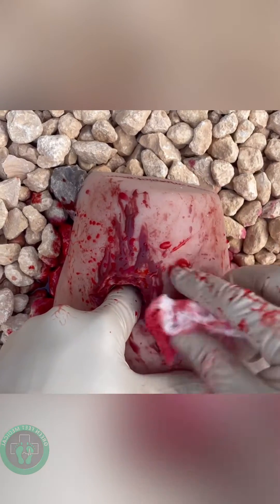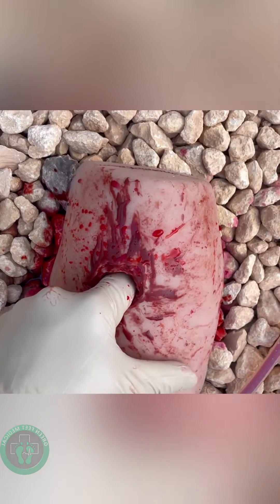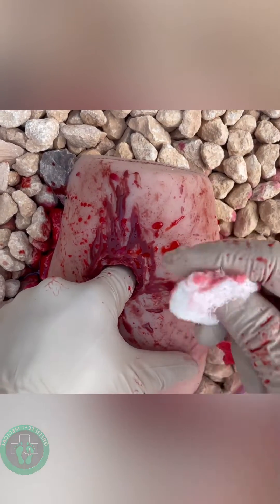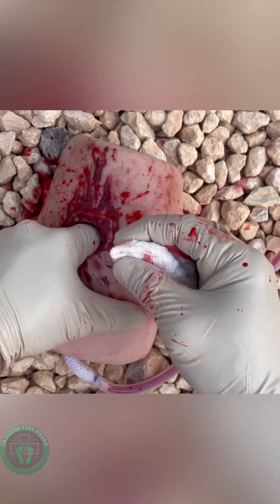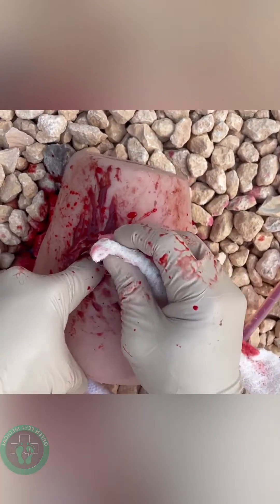So once I've found the bleed, I can visually inspect. If I can't visually find it, I'm going to feel for it. Then I'm going to take my gauze and create a power ball by simply wadding up gauze appropriate to the size of the wound. Once I've done that, I'm going to push and replace.